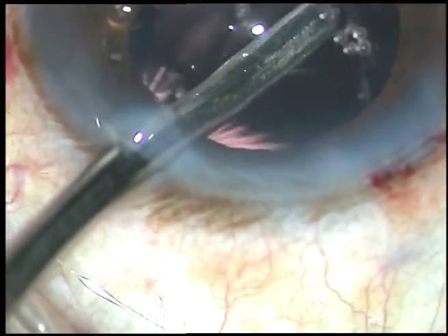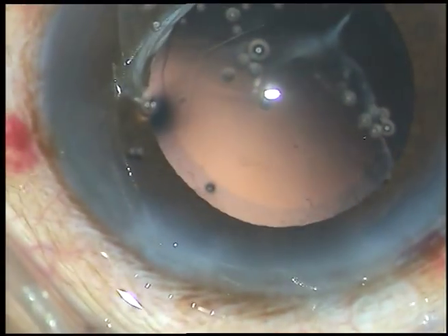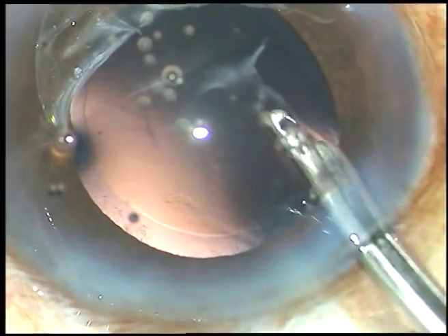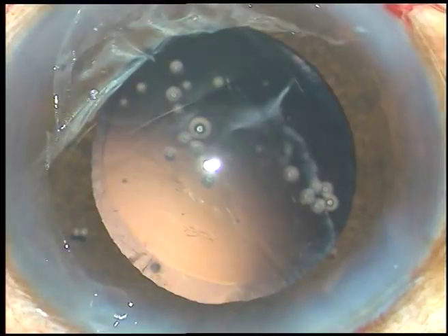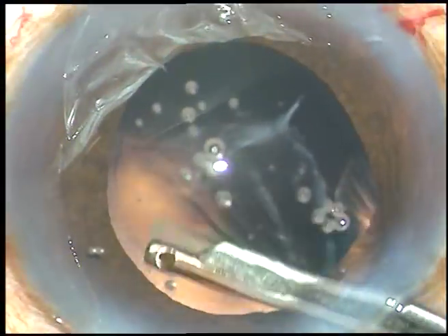This is a 23-gauge Simcoe cannula. The side ports are about 3 o'clock hours away from the main incision — slightly large, say about 1.5 or 1.6 mm. This slightly larger side port will help reduce the astigmatism produced by the main incision.